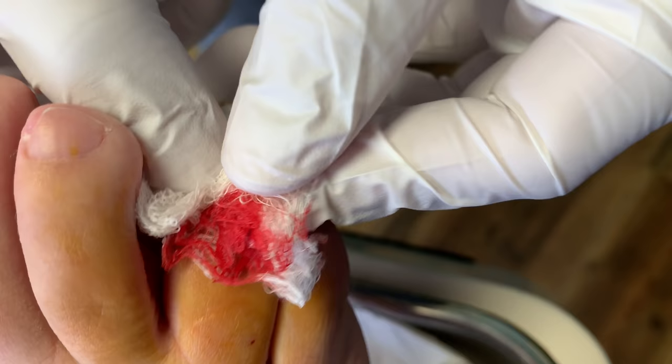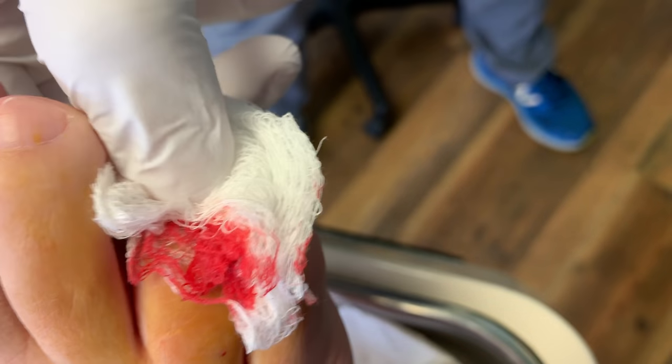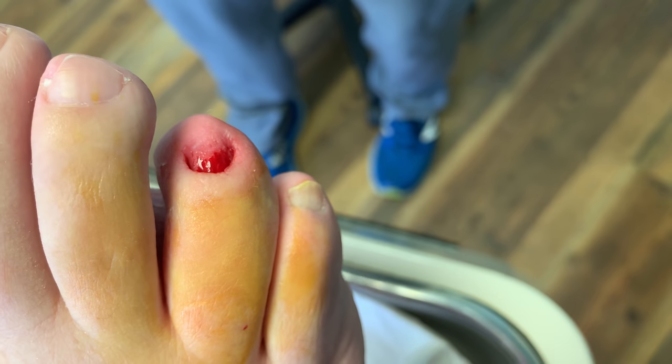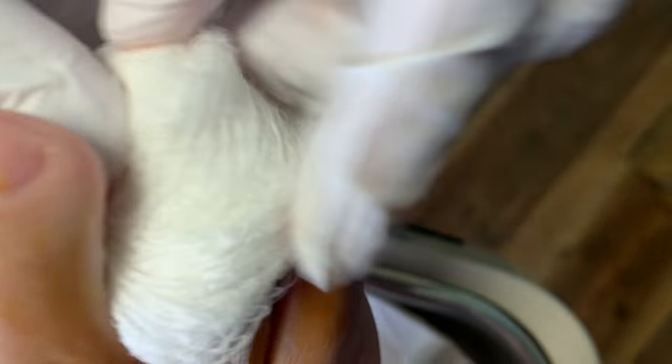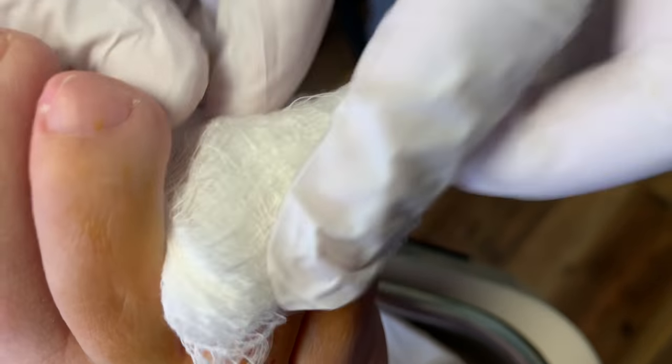So what we do — and someone neglected to put it on the table — is Adaptic, a non-adherent gauze. Don't forget the word Adaptic. I'll show you what it is; I'll get it out of the drawer.